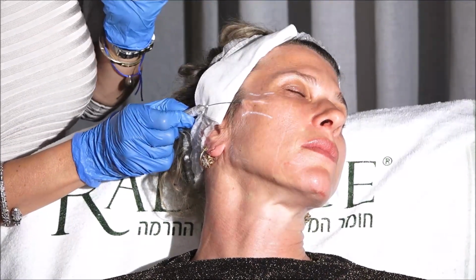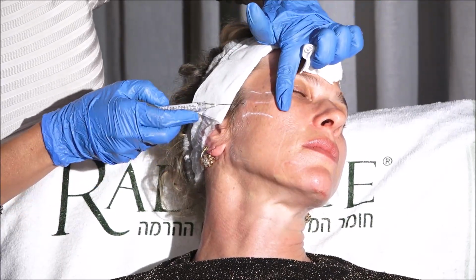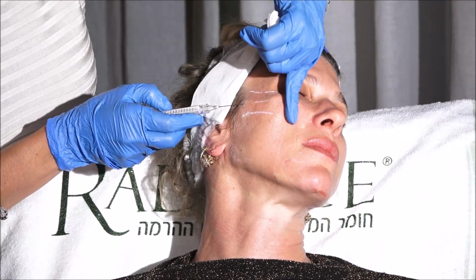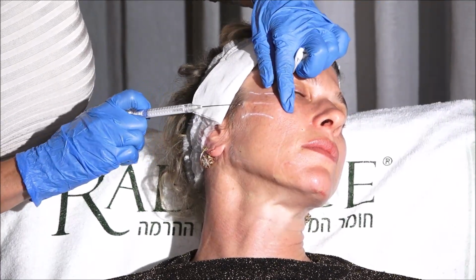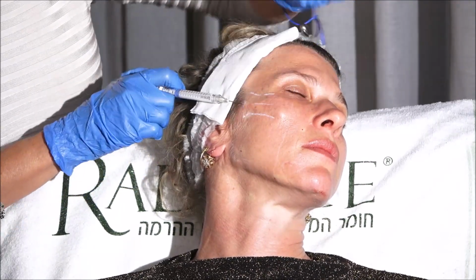So I want to be as superficial as this, but I don't trespass the lateral face. The lateral face line of ligaments is the canthus, zygomatic ligament, mandibular ligament. It's more or less here. So I get my cannula to the lateral face, and I retrograde with 0.1 per trace.